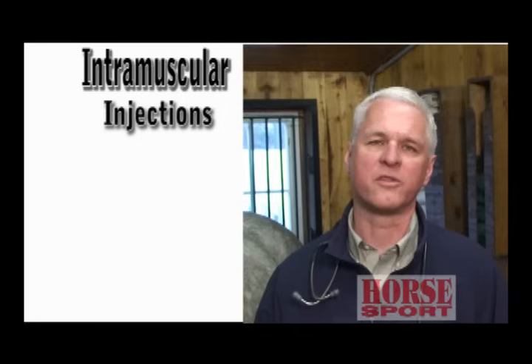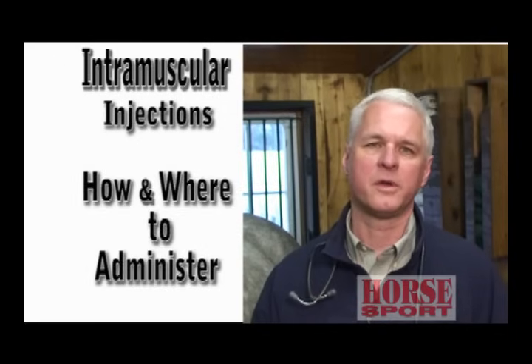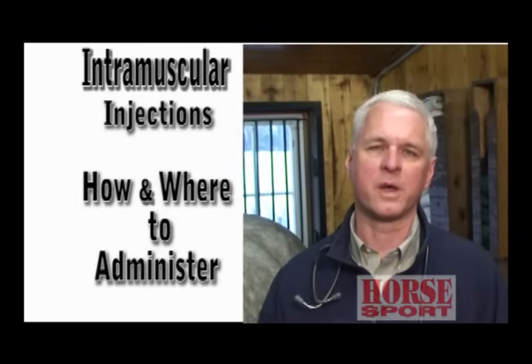Hi, I'm Dr. Mike Paunel. Today we're going to talk about giving your horse an intramuscular injection and how to do it. Often, medication is left for you from your veterinarian that you need to give once or twice a day for three to five, maybe even more days, and often giving it in the muscle is the best way to do it.